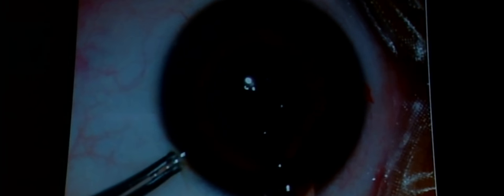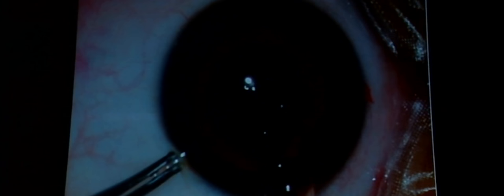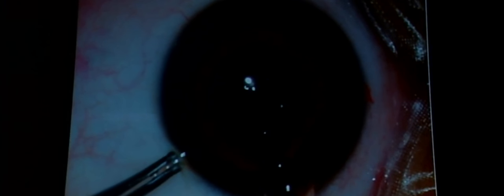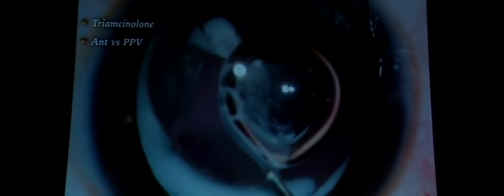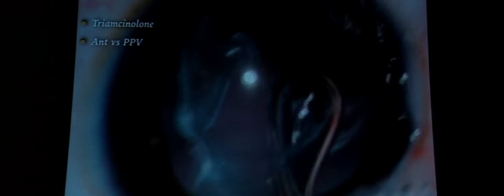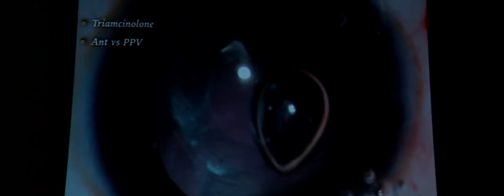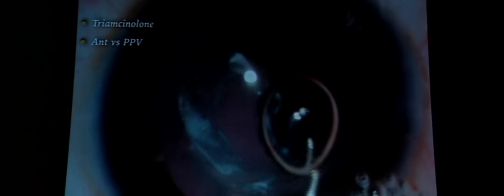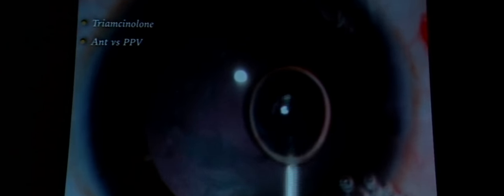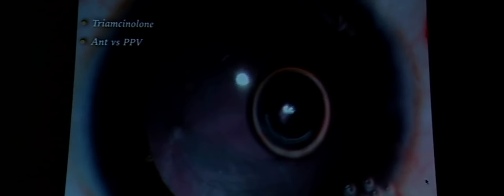Femtosecond laser could be used, but the child would be under GA, so transferring from the femto table to the operating table would require a ZEISS machine. Anterior vitrectomy is performed in every case where I do a posterior capsulotomy, as the anterior vitreous face acts as a scaffold for posterior capsular opacification, with lens epithelial cells growing on it to form a sheet.